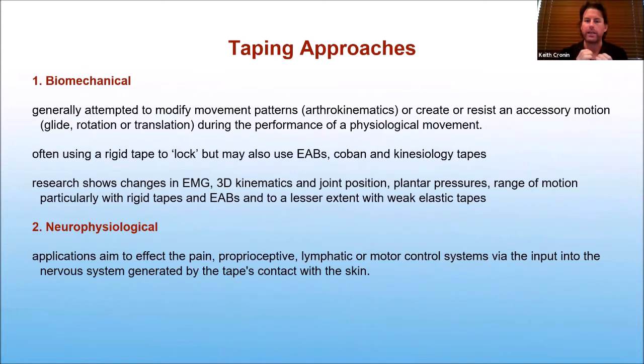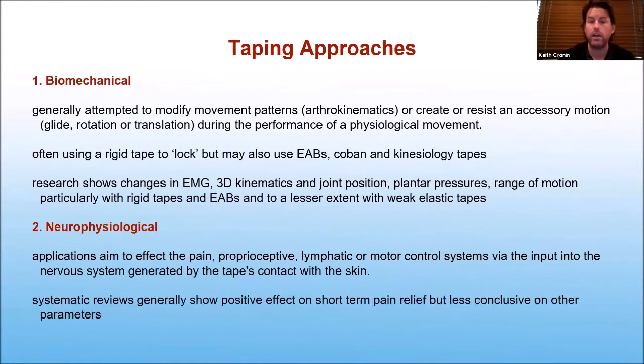So when we have a biomechanical approach, we're probably familiar with that with rigid taping, right? You put it on the body, it stops it from moving. Well, that's great, but it doesn't allow you to move, and we need movement to be able to heal. So knowing that, using this biomechanical approach, which is step 2 in this phase here, it allows us to get the neurophysiologic effects, which is just putting tape on somebody, but then also being able to change the way that people move.